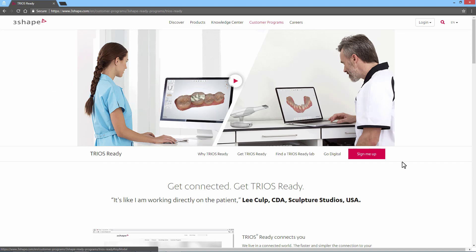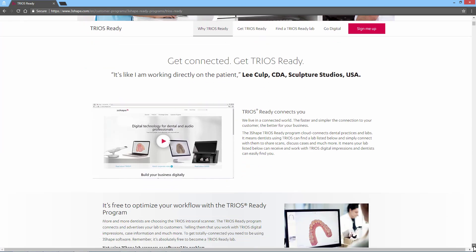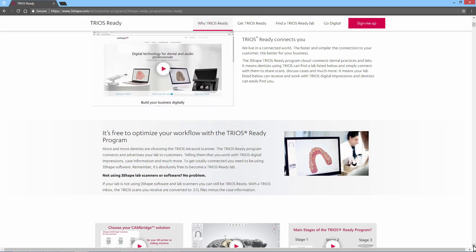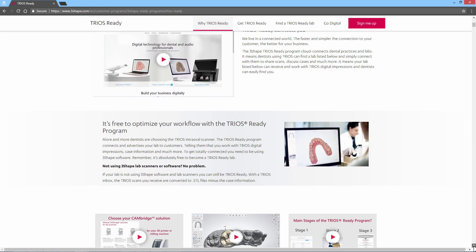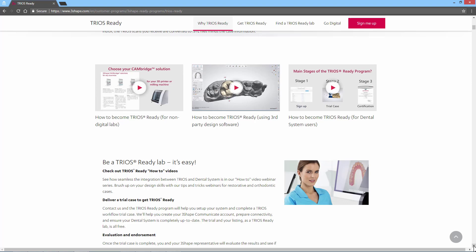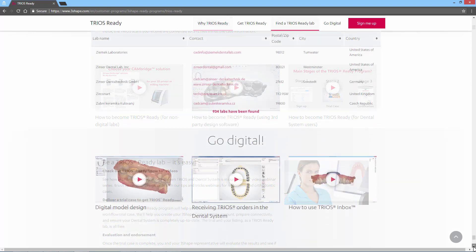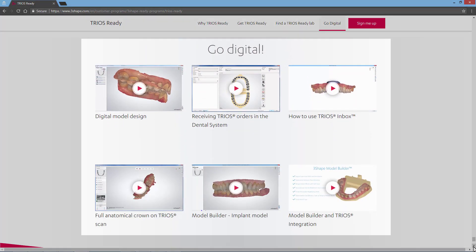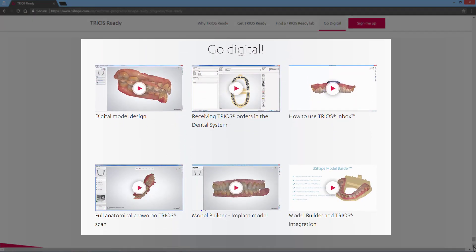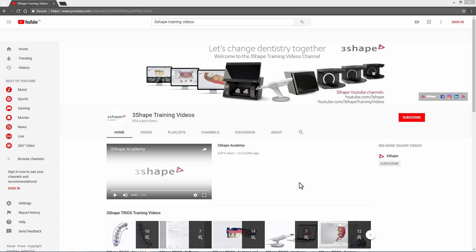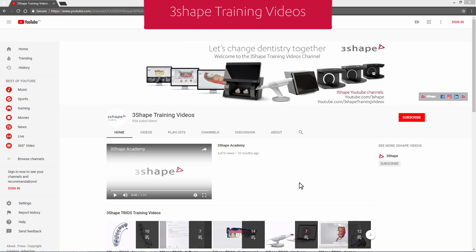On this page you'll find all the details about the TRIOS Ready program. Please note that at the bottom of the TRIOS Ready page, you'll also find the links to training videos that will be useful in practicing the skills necessary for the TRIOS Ready customer program. You'll find more videos uploaded on our YouTube 3Shape Training Videos channel.